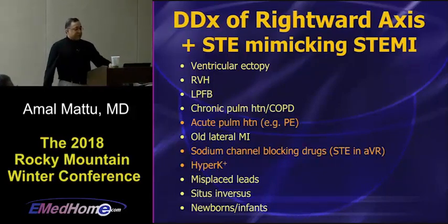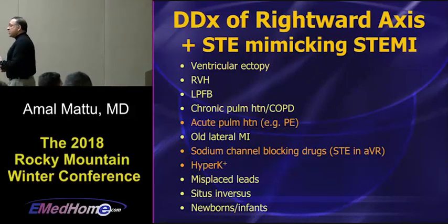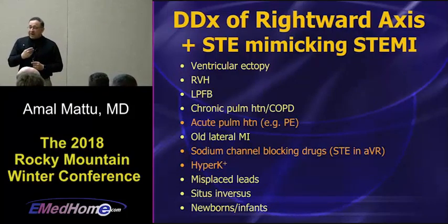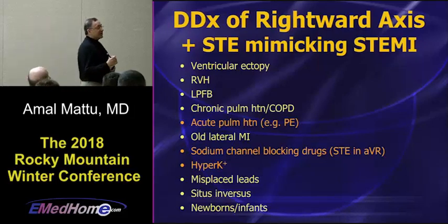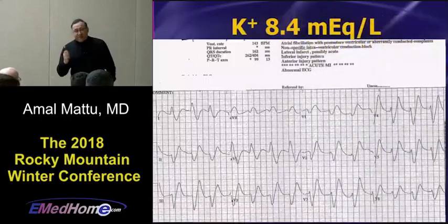I highlight sodium channel blocking drugs, but again, I'm emphasizing I've only ever seen sodium channel blocking drugs produce ST elevation in aVR. So in my practice, what I teach, when you see ST elevation in combination with the rightward axis, the first, second, and third thing you're thinking of is PE and hyperkalemia.